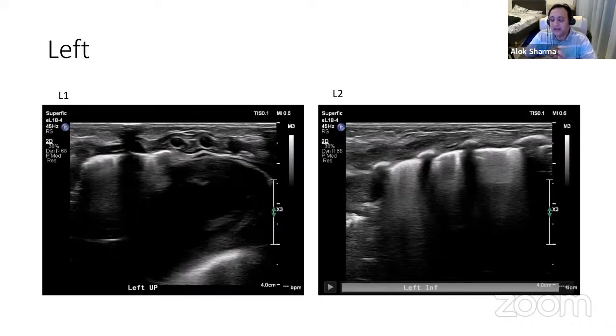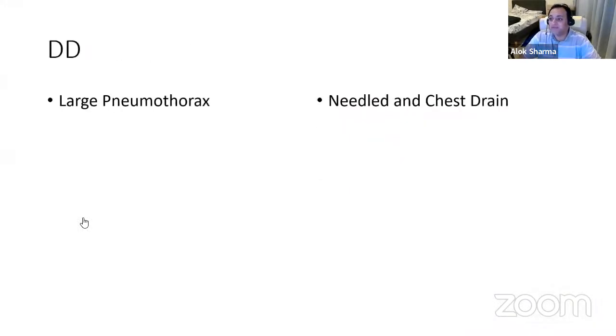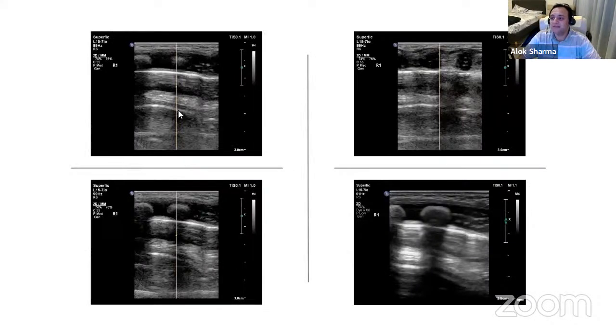There'll be more research. And I think that's where, while you're learning and being able to clinically correlate, it gets better with time. I'm going to be really honest with you, even if you're not doing beautiful, crisp, fantastic, lovely ultrasounds, you can make a diagnosis. That is important. So I would like to say to the people who don't have a linear probe, don't worry about it, because you can still make a diagnosis of a pneumothorax with a poor scanner like this.